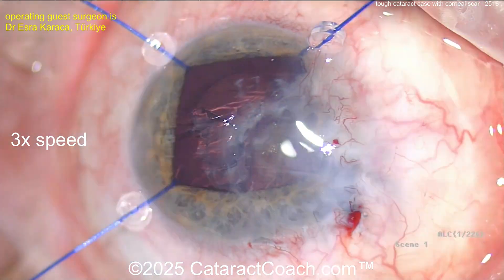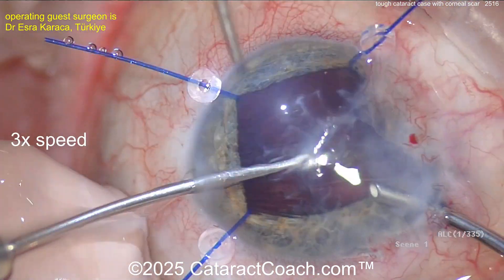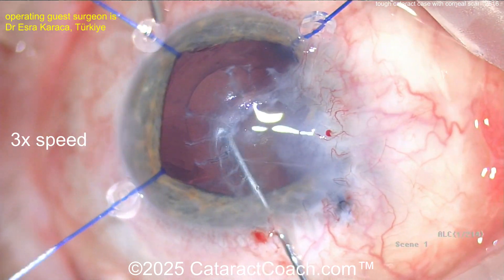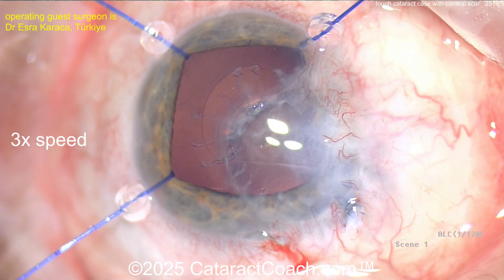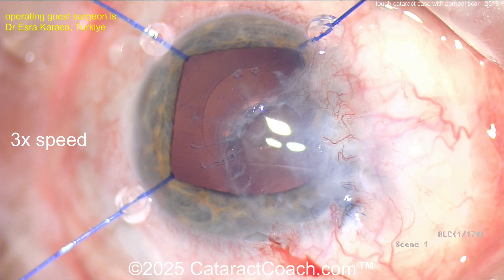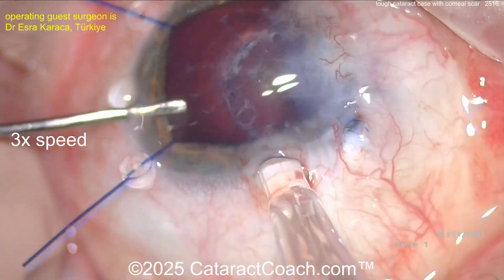The patient will obviously get a monofocal lens here. Sometimes you'll be asked why not do a corneal transplant at the same time — well, you could, but remember a lot of these eyes can achieve surprisingly good vision just by fixing the cataract. Many patients have had these corneal scars for a long time and may do okay. You may also be in a part of the world where it's not easy to get tissue for a corneal transplant, or you can use a stepwise approach.